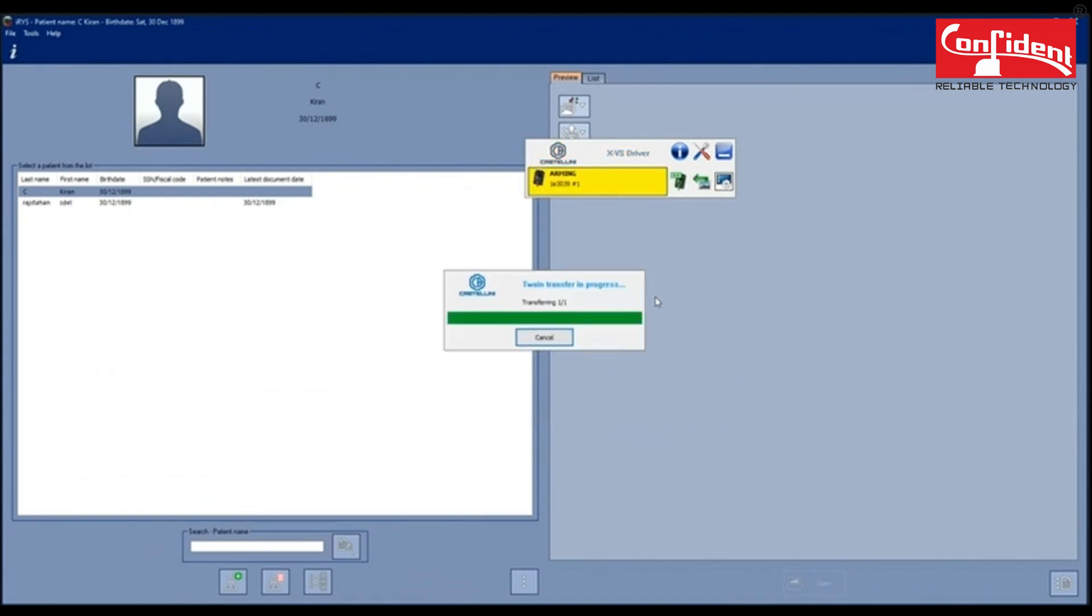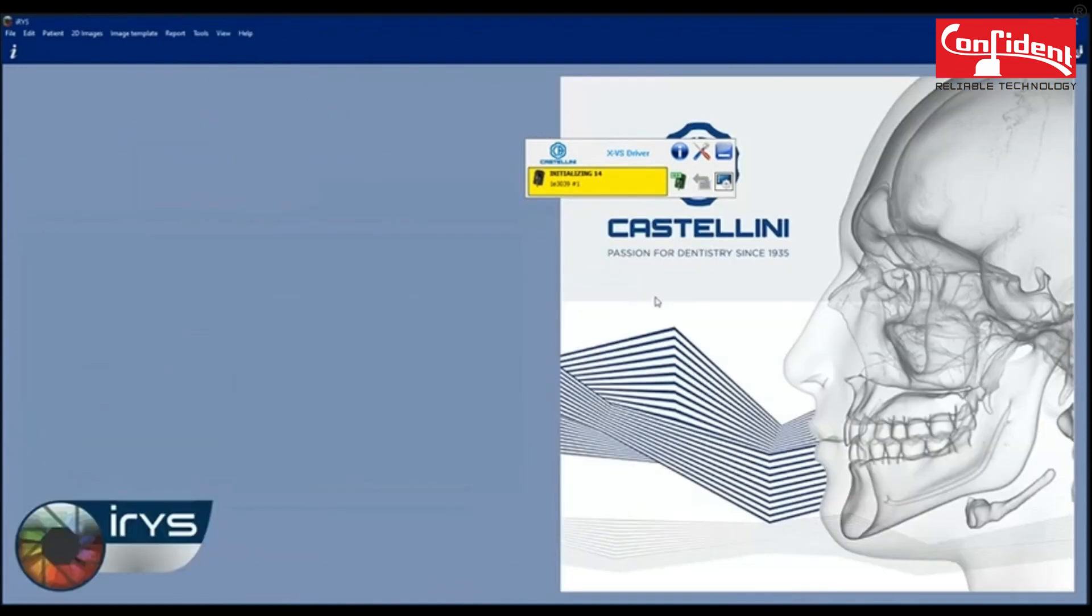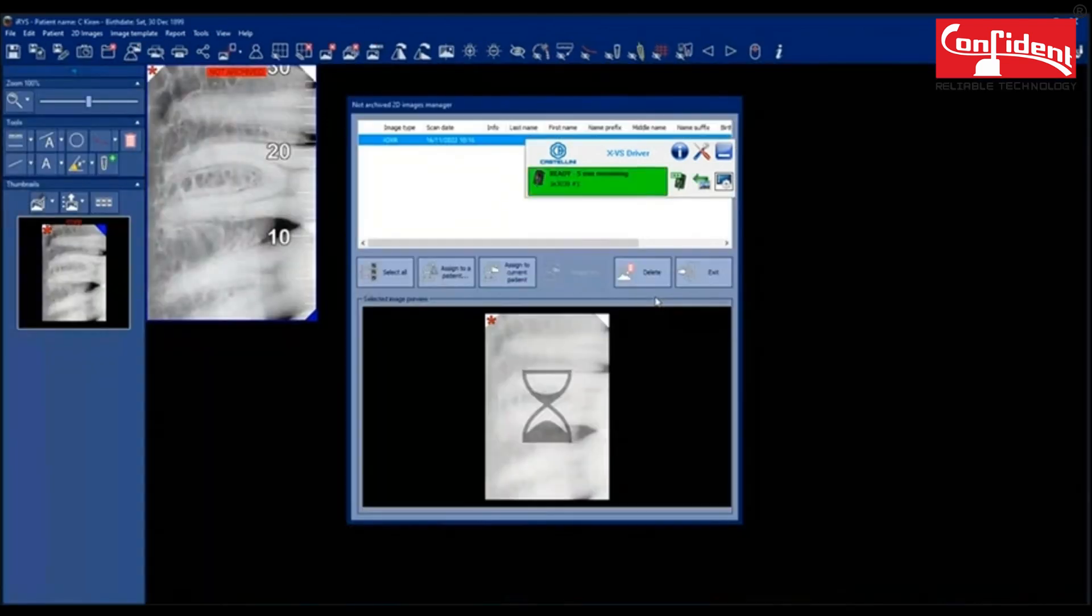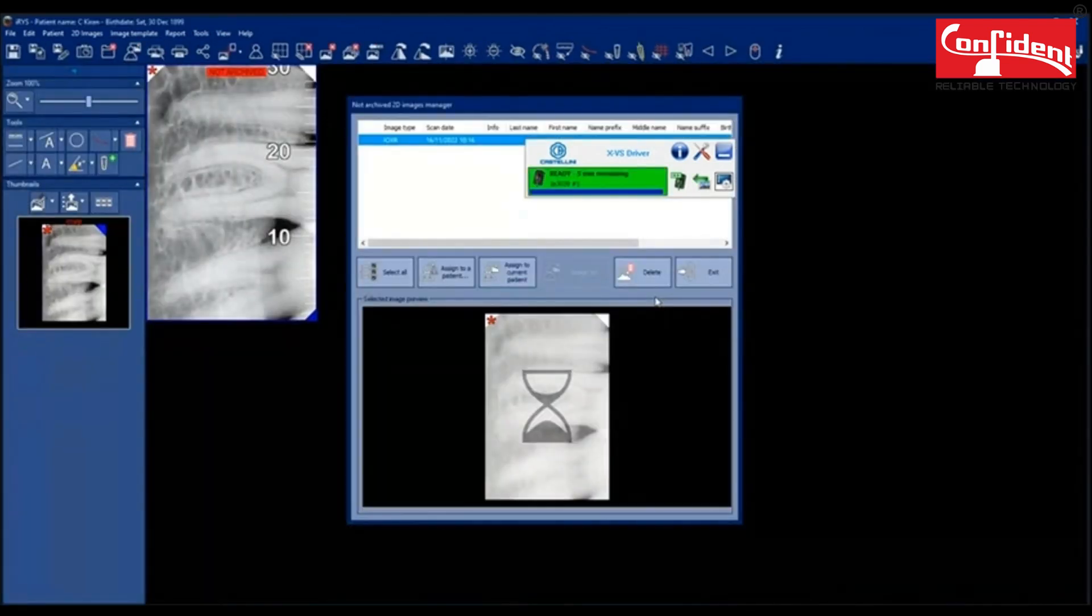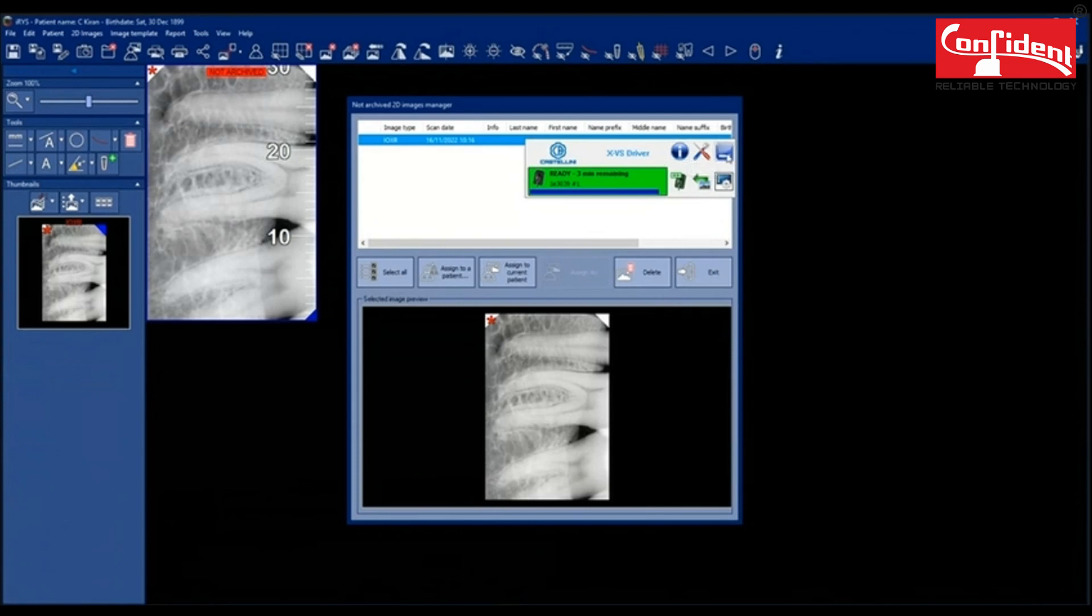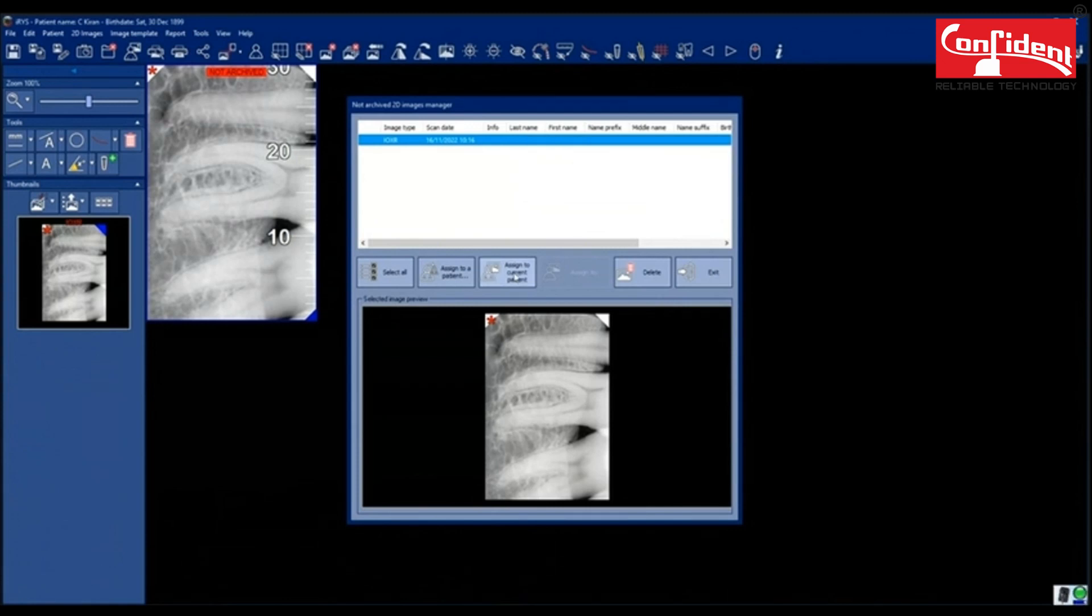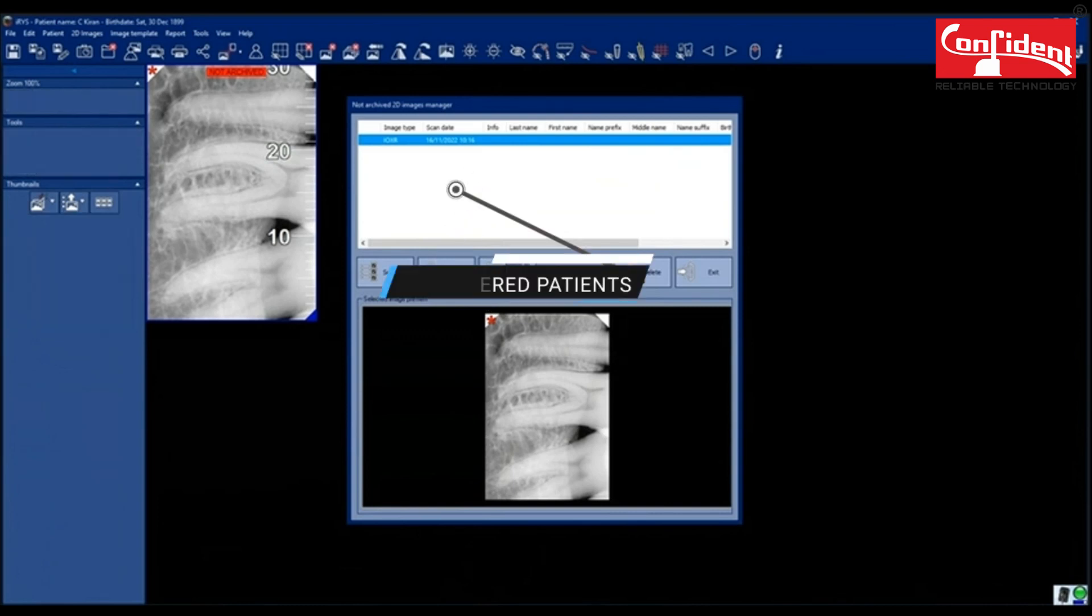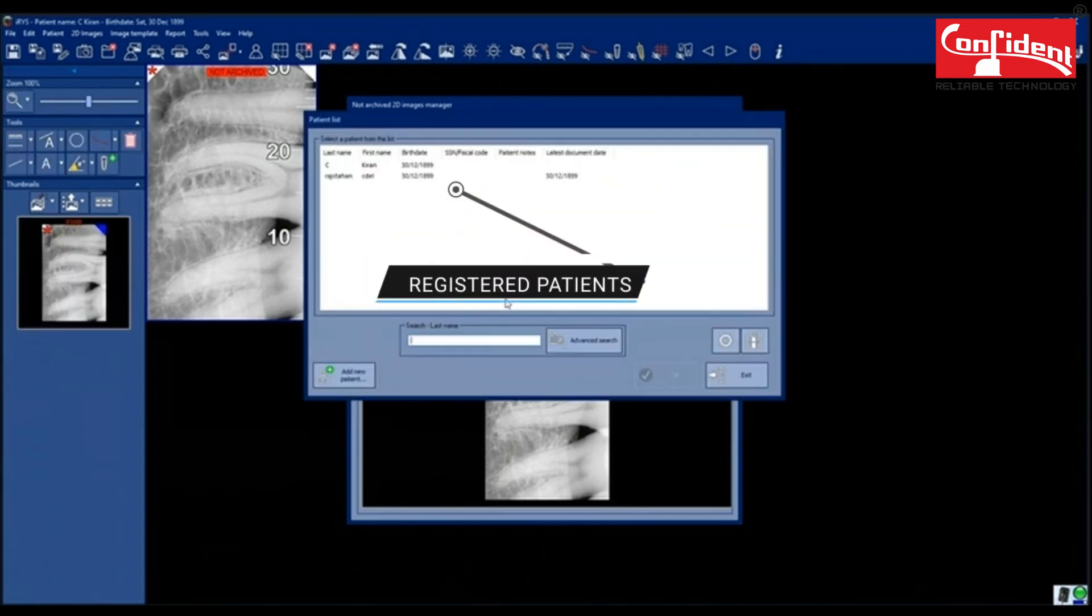As soon as you scan, the image is transferred to the application. Now you can assign this image to a current patient or to another patient by selecting the already registered patient.